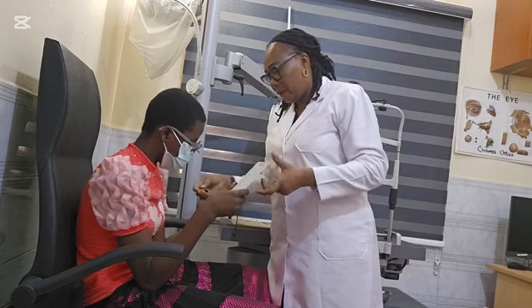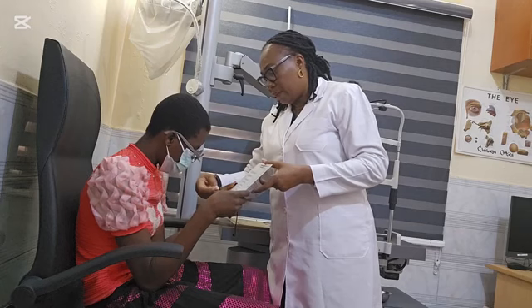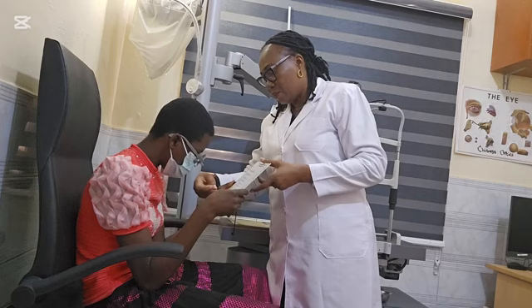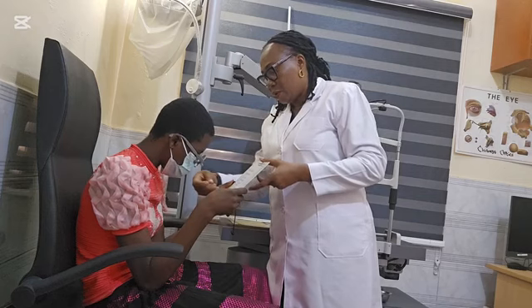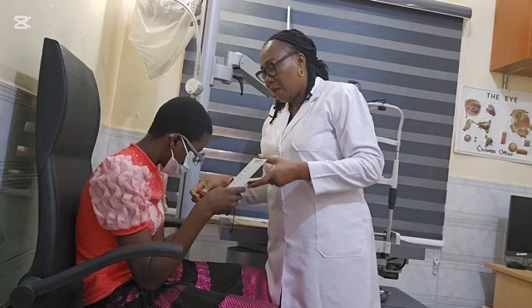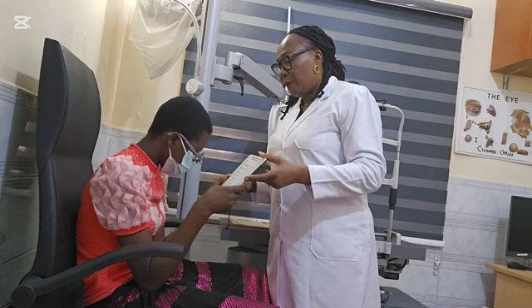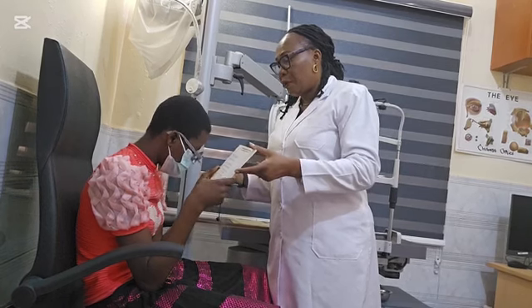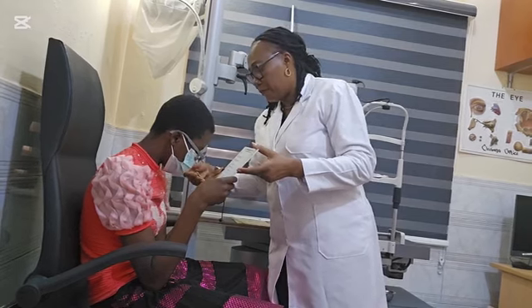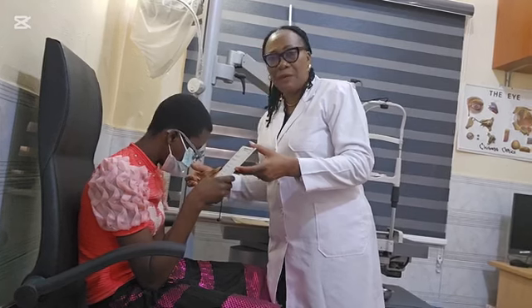Binocularly, read, continue from here, let's see. Soon. So binocularly here, she could read 1.25 M at 25 cm. At proximal, she could read 1 M. Proximal at 12.5 cm, she could read 1 M.